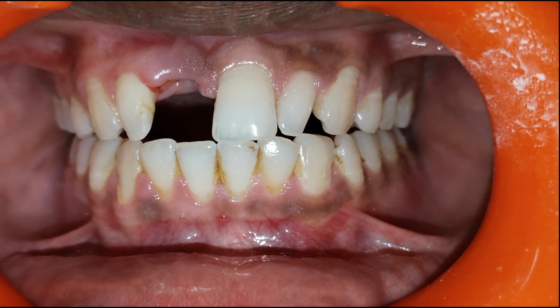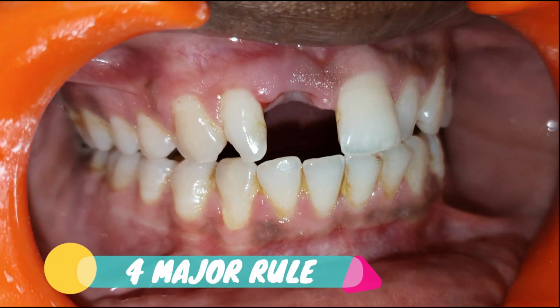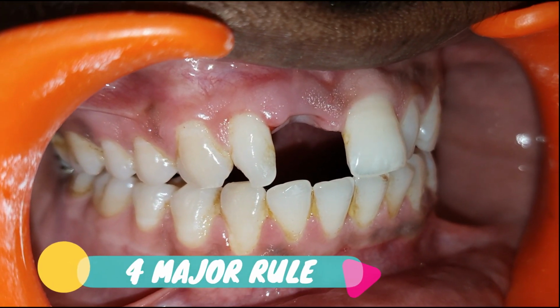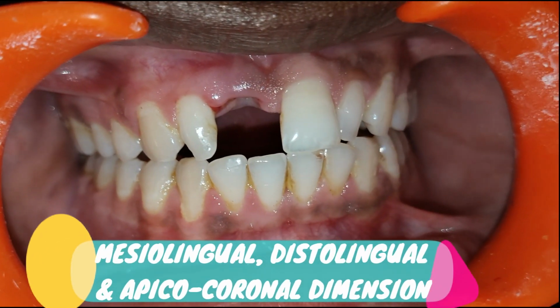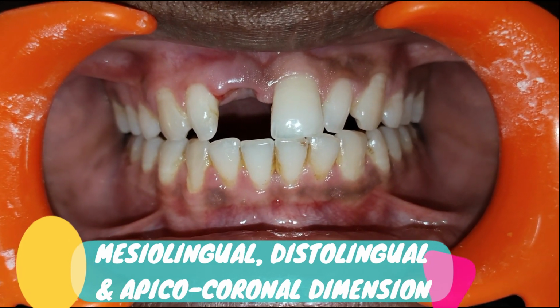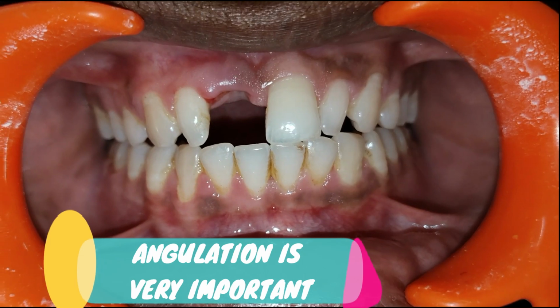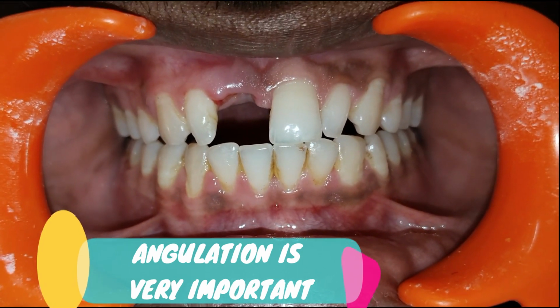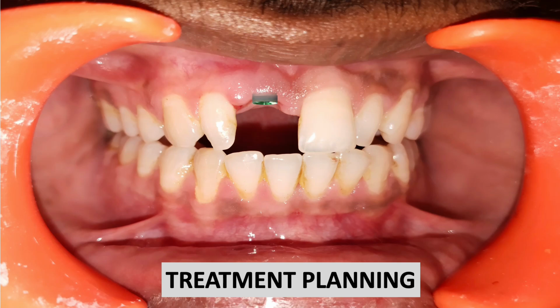For the success of the implant in the maxillary anterior region, we have to stick to four major concepts. First, the implant should be in appropriate position in mesiodistal, faciolingual and apicocoronal dimension. An implant should be placed in correct angulation and of correct size. Very important. So how to select implant width?